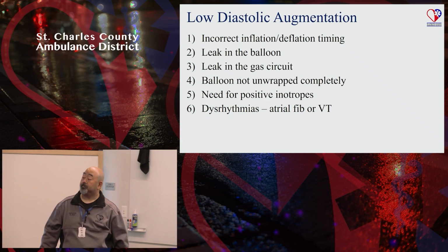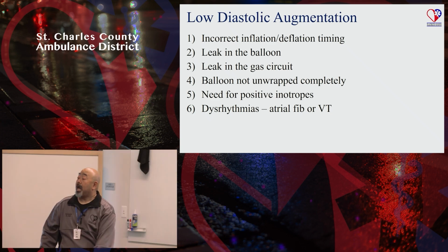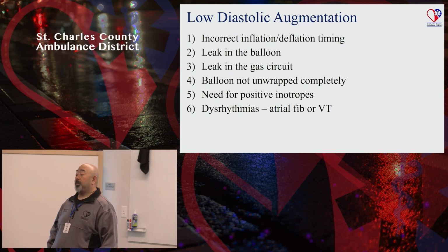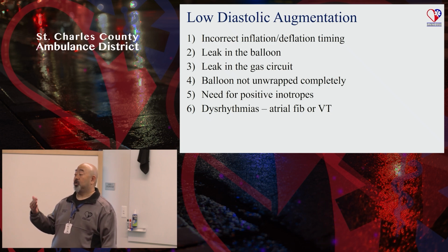Is that why the pitch for the Impella is that they'll eventually phase out the balloon pump? I think it's for a couple reasons. One, because it's a lot easier to place. But two, because the Impella is actually augmenting the heart's function and directly offloading the left ventricle. And everyone knows how to put central lines in under sterile technique. So muscle memory wise, it's very comfortable for most practitioners.